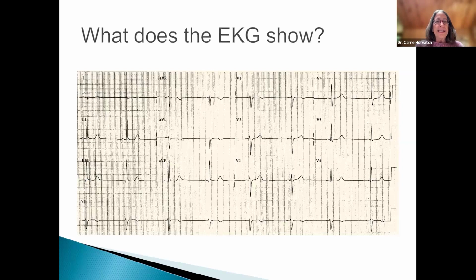And this is his EKG. So what do you think his EKG shows? Remember rate, rhythm, axis, the intervals, and then depressions or elevations.